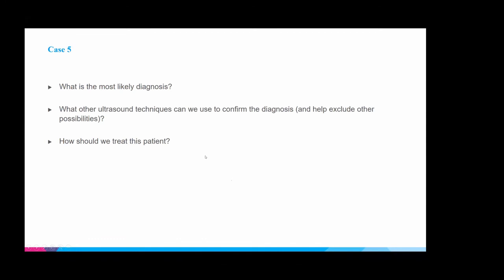Based on his clinical scenario and what we're seeing on ultrasound, what is the most likely diagnosis? Acute pulmonary edema from the hypertension. Yeah, absolutely. And what else could it be, I suppose? How would we use ultrasound to differentiate it from other things? So we can check the pleura to see if it's cardiogenic versus non-cardiogenic pulmonary edema. Excellent. If you see like the shred sign.